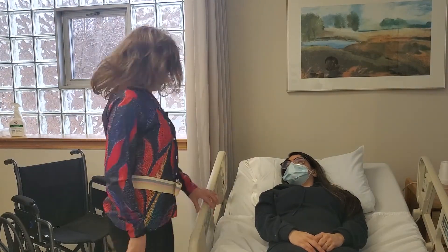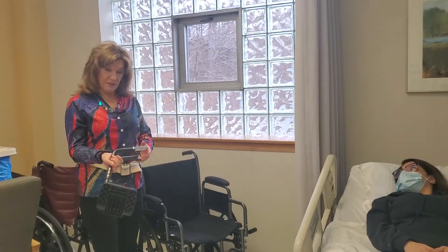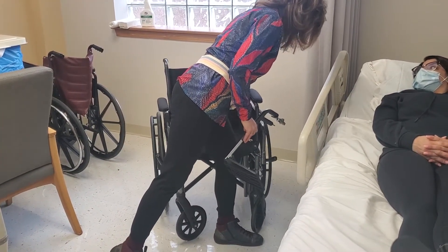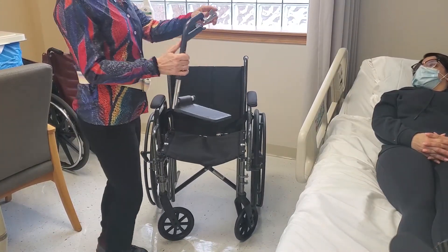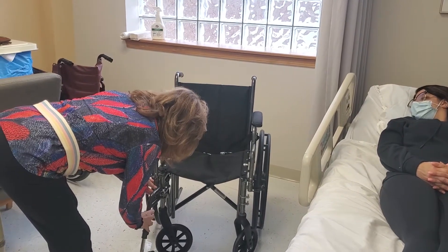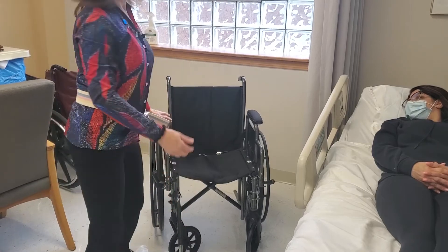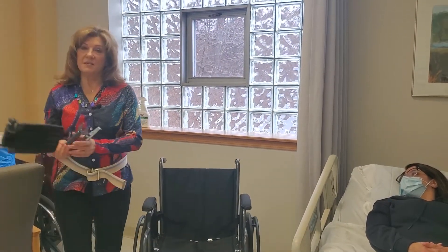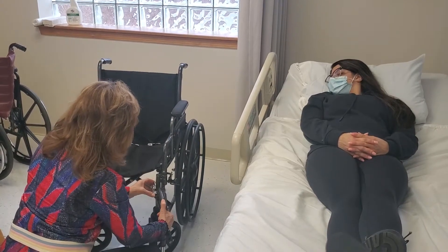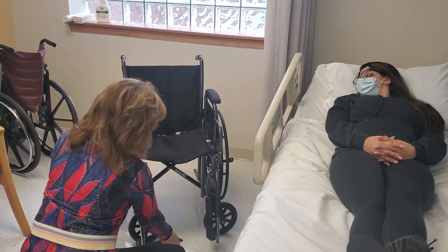The first thing you're going to do is position your wheelchair. We have a nice wheelchair here. It already has leg rests on it — I'm going to put one back on to show you how they look. Make sure you use the little clip on the inside of the chair, and you can see the little holes. They fit right like a puzzle piece onto the chair area and should snap in place. I'll put the other one on now because when we get Cassandra out of bed, we're going to need them. The other one has a clip on the inside of the chair — you clip it on, let it sit on the little holes, and it snaps. Now we have both leg rests ready to go.